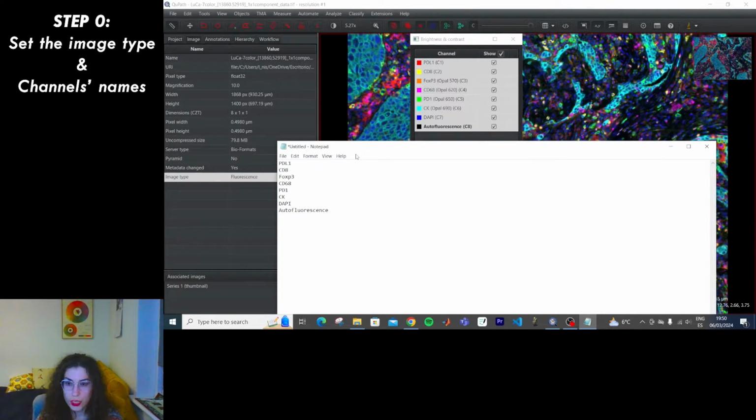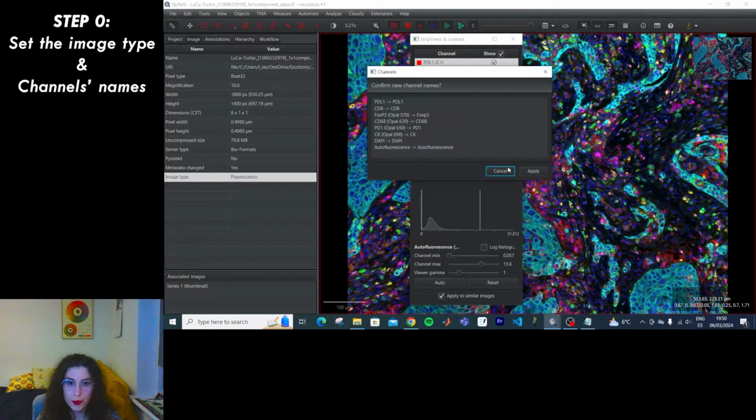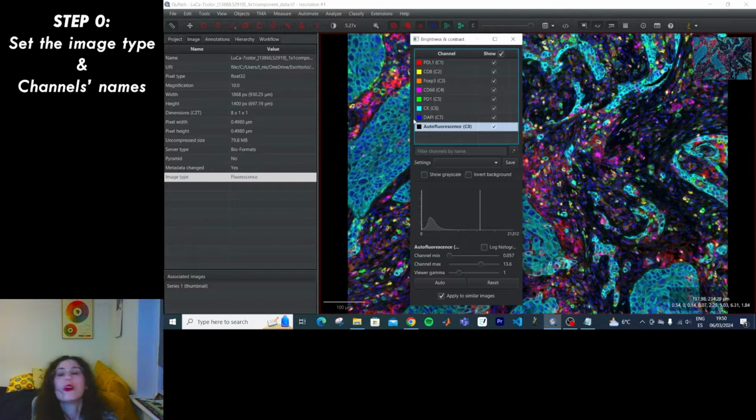Okay, Control A here, Control C to copy them all, and then Control A here as well, and Control V. And then I change them all. I don't know if that was easier than just deleting parts of it, but okay, I've changed the channel names. That's the first thing.